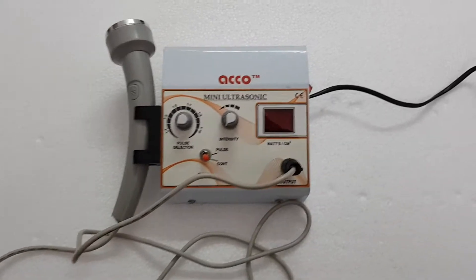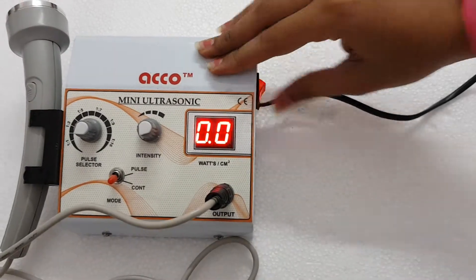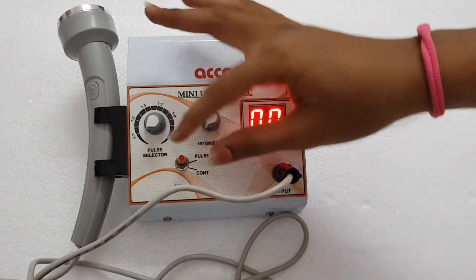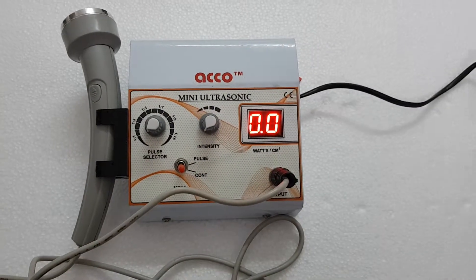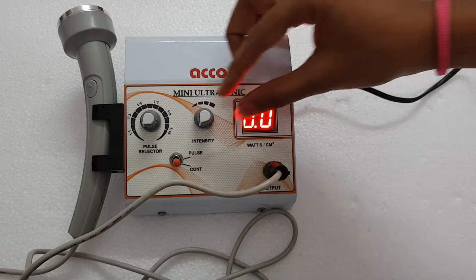We will now show you the demo of the Echo Mini Ultrasound Therapy Unit, 1 megahertz. Switch on the machine, select the mode as per your need — pulse or continuous. You can select the pulse ratio from here. Now increase the intensity as per your need.